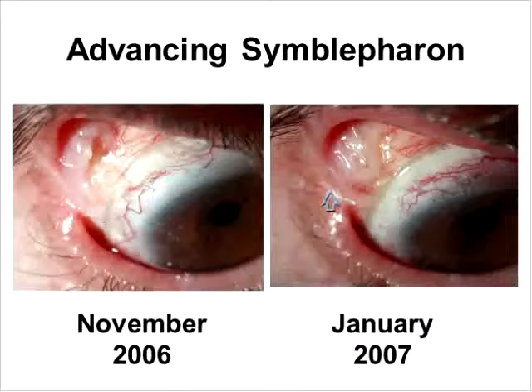But it didn't quite work. The tissue had a mind of its own, and you can see in this area just the bulk of this tissue that's not having a lens interaction had advanced just in a few short months. So this same lens from this eye has now been decentered. The eye is more angry. It's a redder eye. You're seeing more compression.